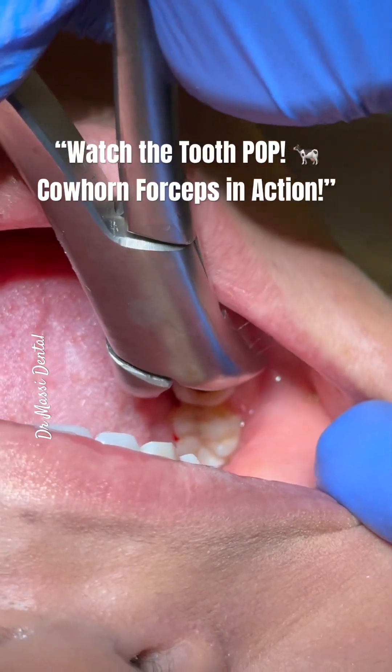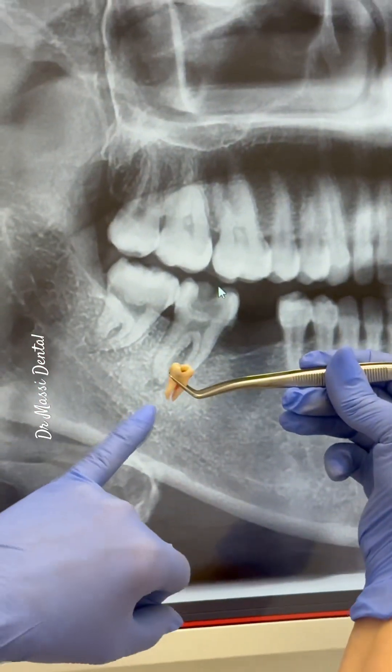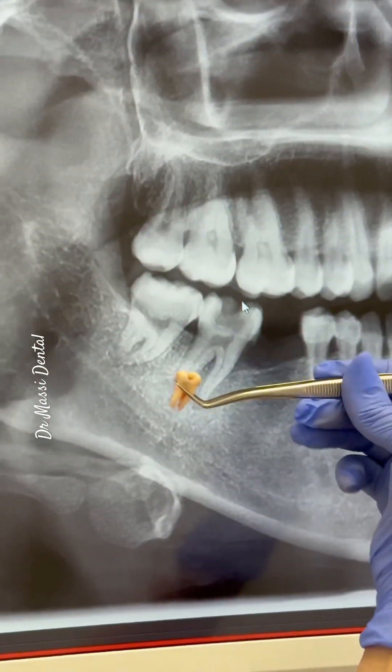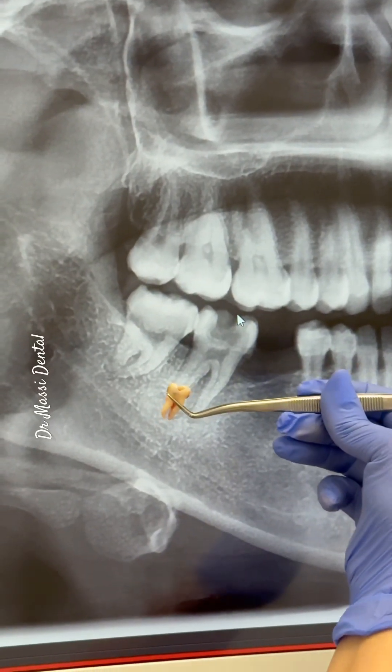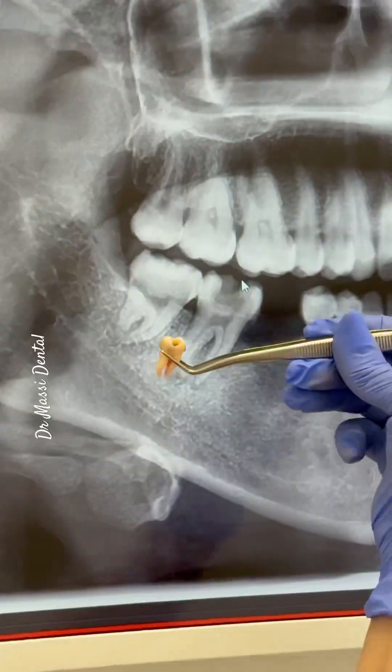We are hogging this way and moving left, right, left, right like this. And the tooth is out — here we go. In one shot with the cow horn forceps, we take that tooth out.